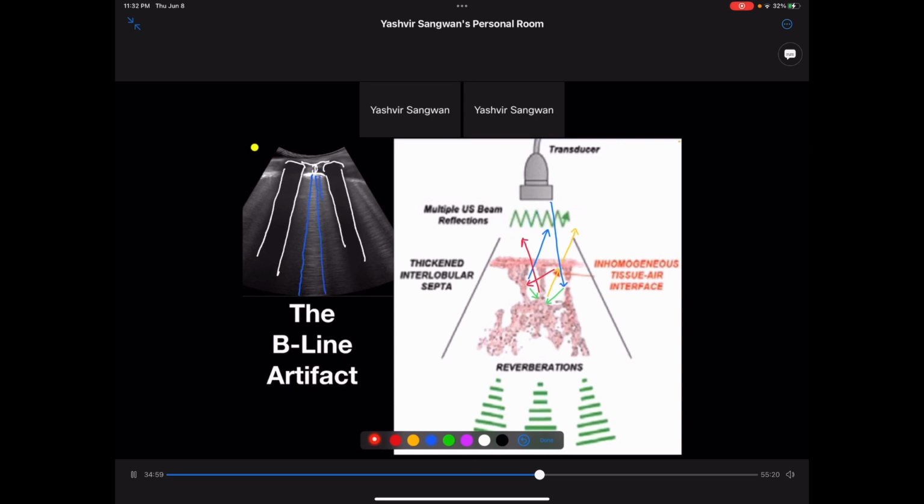If you have a sick patient, of course all our patients are sick and they are lying down in the ICU, you will get 1 or 2 lines in the bases of the lungs because of atelectasis. But more than 3 lines, bilateral lines, lines that have come to the anterior or lateral surfaces, are usually pulmonary edema, especially if they were not there before you started giving fluid. So if I start giving fluid and I see these B lines, that means pulmonary edema is waiting to happen.